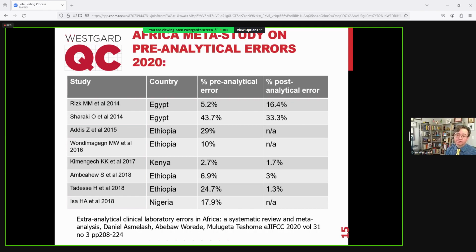So there's a lot of variability, you could say, in the studies, but also in the places that they're looking. So we might have a perception that pre-analytical errors are the only thing, and they're the most thing. It's going to depend on your facility. What are you looking at? And even maybe what country you're in, what resources are available to you, what level of staffing and skill in the staffing is available to you. So the conventional wisdom might be an interesting starting point, but you have to check it out yourself and know what your own sigma metrics are, know what your own error rates are.